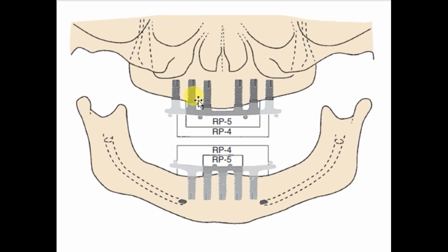Removable restorations have 2 categories based on implant support. RP4 prostheses have complete implant support, anterior and posterior. In the mandible, the superstructure bar often is cantilevered from implants positioned between the foramina. The maxillary RP4 prosthesis usually has more implants and little to no cantilever.